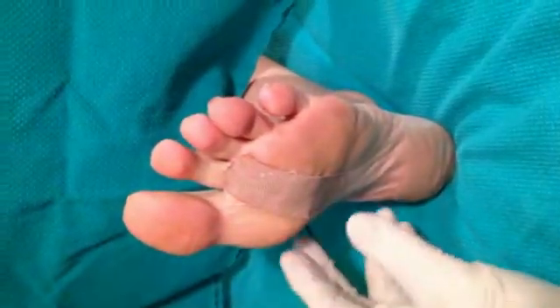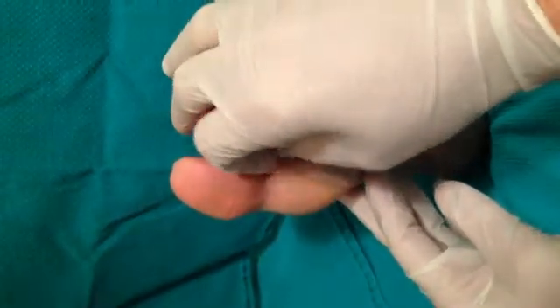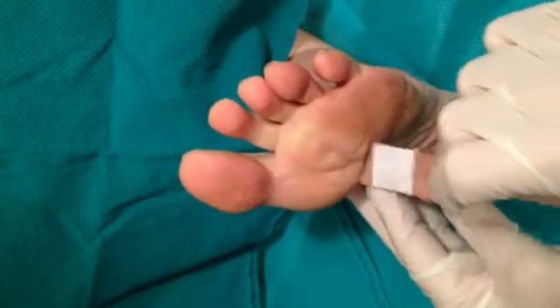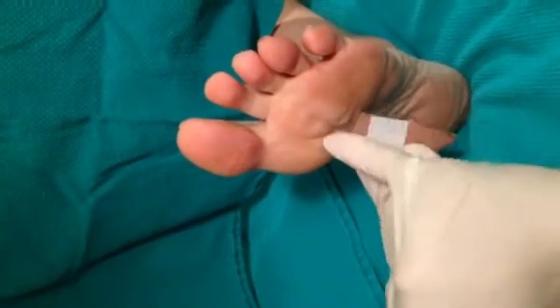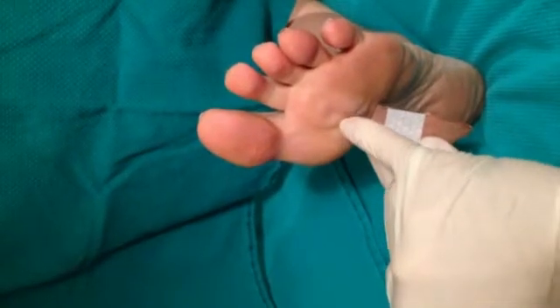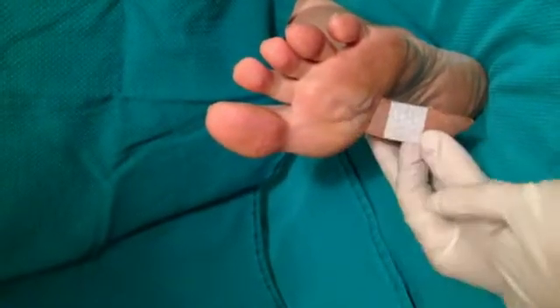We are now going to be removing the bandage that has been occluding this keratotic lesion for the last 24 hours. Immediately you can see the turgidity of the tissue here — this is where the central core is located. This tissue has now been softened and we will be able to do the debridement now.